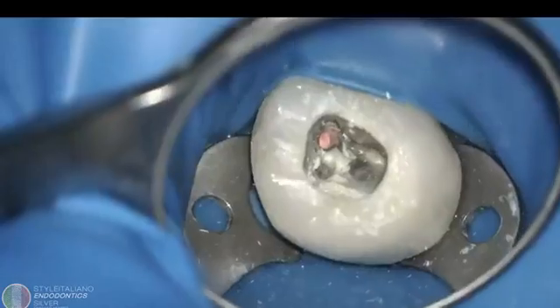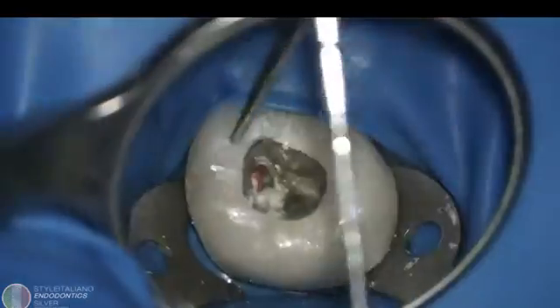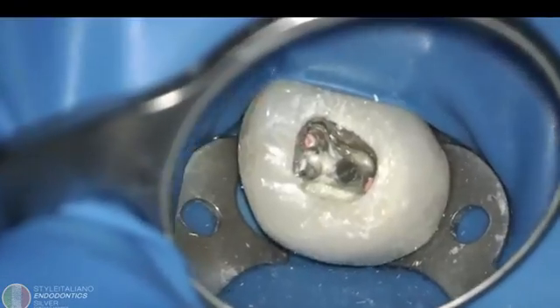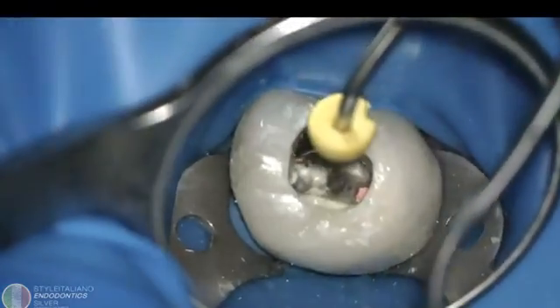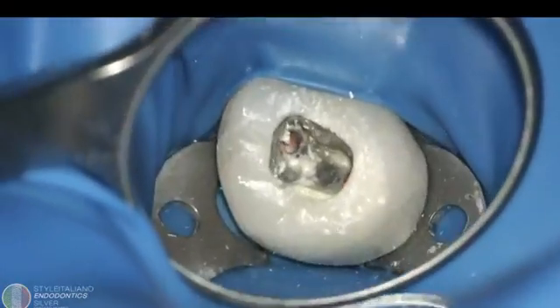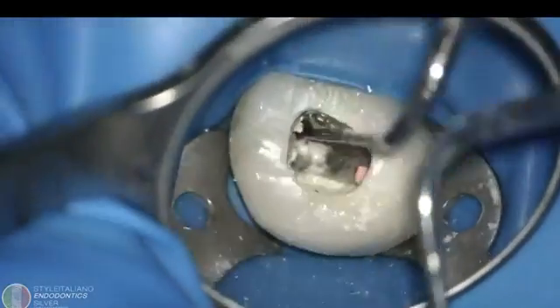That's why I'm showing in the mesial canal how I am using this classical vertical compaction. And you can see when using the microscope, we can see very easily inside the canal. So we can very well go inside and do our compaction very easily.